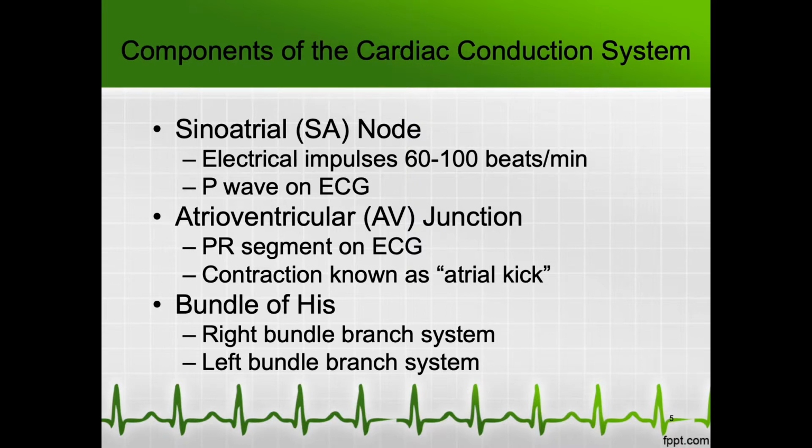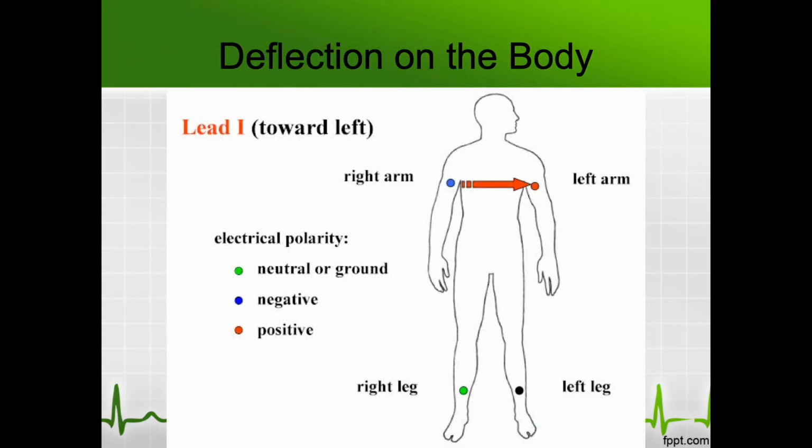Normally, the energy of the heart travels in a specific direction. If we look at anatomy, we see that the SA node is in the upper right-hand side of the body, and that energy descends downwards and slightly leftward. Well, this diagram shows that when we look at these EKGs, in other words, when we're using the EKG as a sort of camera to determine where the electricity is going, we watch to see where that energy comes from and where it goes to.